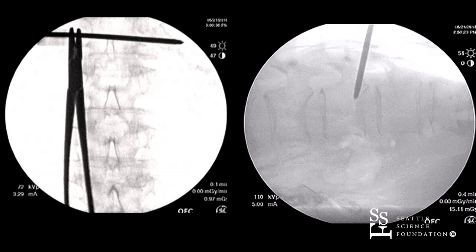For kyphoplasty procedures, we want to make sure that we are sharpening up the end plates before, and also making sure we're at the right level. We want to make sure that the end plates are sharpened both on the AP and lateral, and we have both those views here.